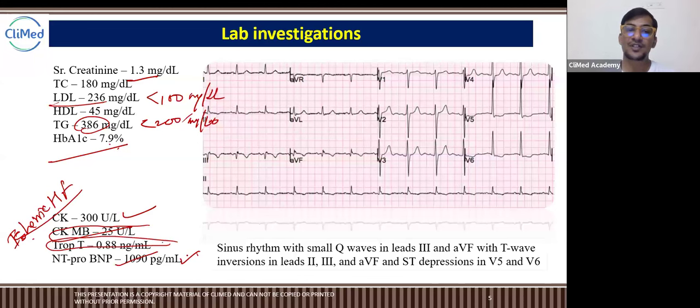So yeah, a vasopressor inotropic agent is there. My next concern is, we did all the blood tests and we did ECG. I'll come to my first topic of today's webinar, after almost 50 minutes, this is ECG. Look at the ECG, guys. What do you understand by ECG? You have read this ECG many times.